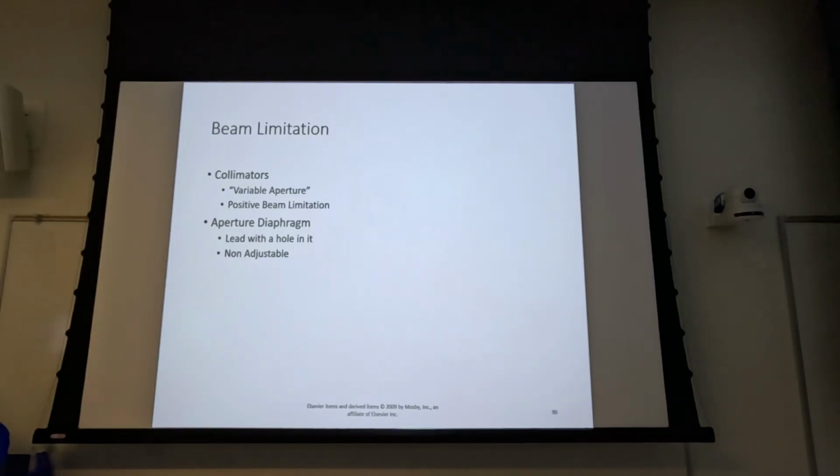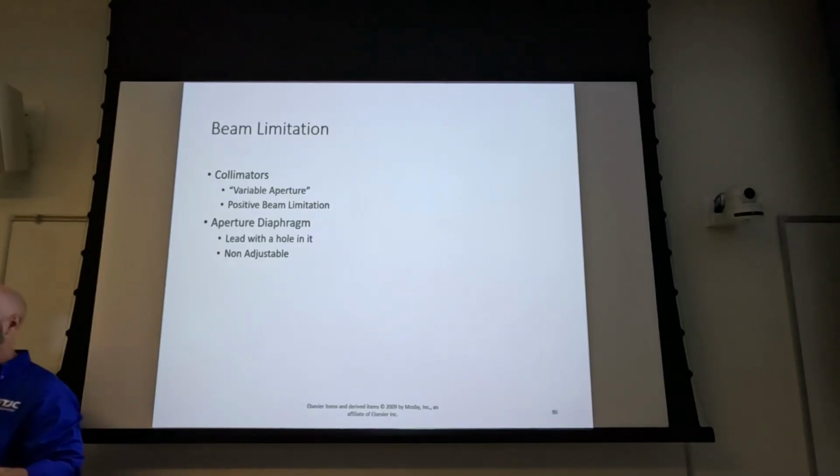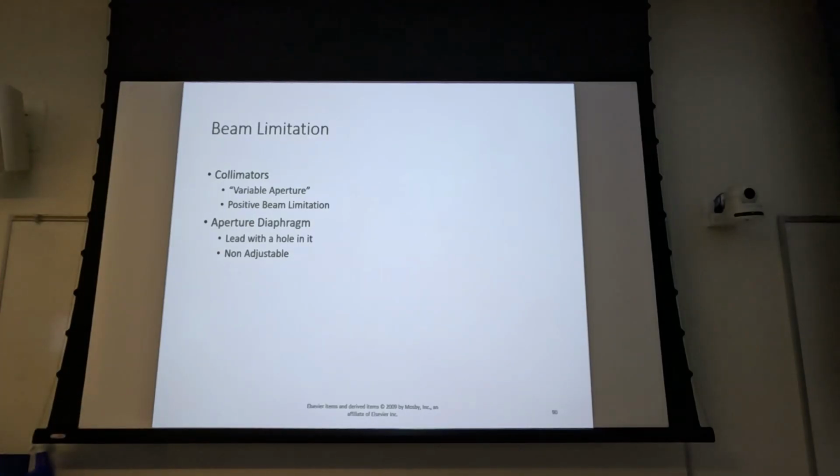If you look at KVP and where it comes to contrast, it has no effect according to the content specifications, which means you should not be tested on KVP in contrast. It's become so insignificant that KVP should not be on the registry in the context of contrast resolution.